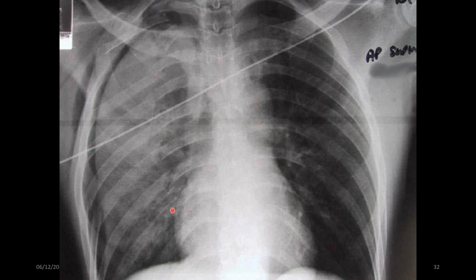So contusion is another fancy word for bruise. So you've got normal lung markings going across here, and then there's increasing density because blood is bleeding from the lungs, like when you get a bruise on your leg, but you have a bruised lung.